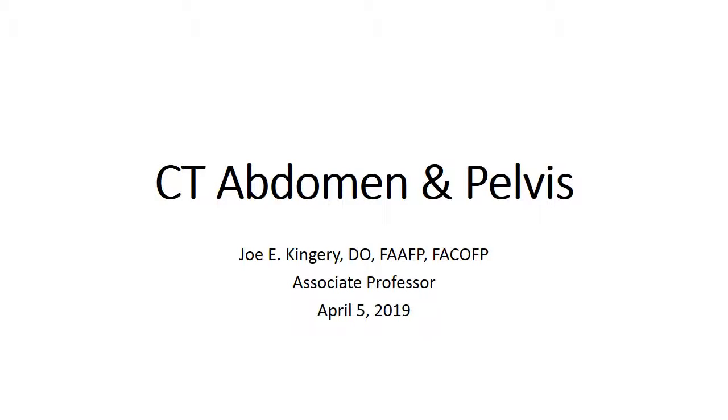All right, let's talk about CT abdomen and pelvis. So, generally speaking, we order a CT abdomen and pelvis. We don't order just a CT of the abdomen or CT pelvis. Reason being because it's hard to differentiate exactly where one begins and one ends on CT to stop the CT scanner. And the other is because pathology runs hand in hand between the two, and also structures that begin in the abdomen go into the pelvis, such as ureters and bladder. So we order it together.